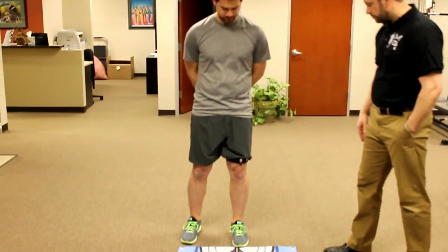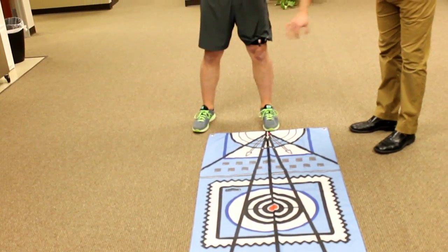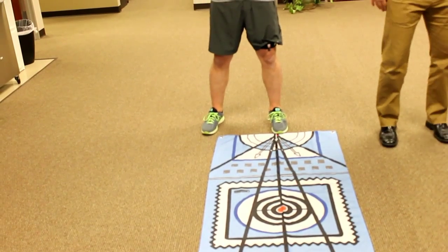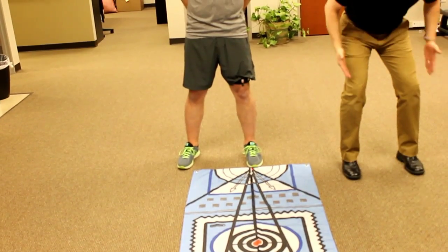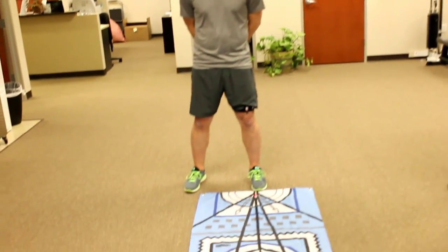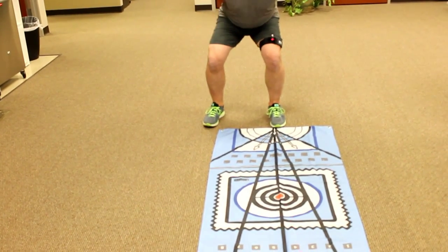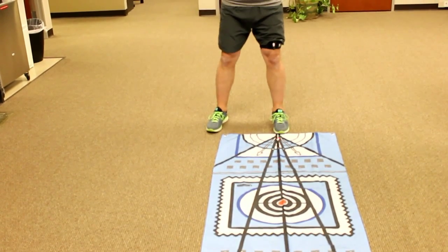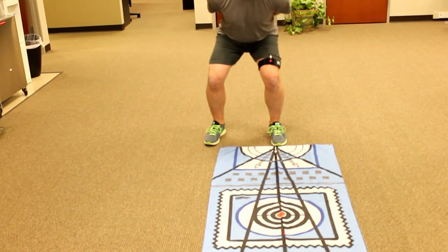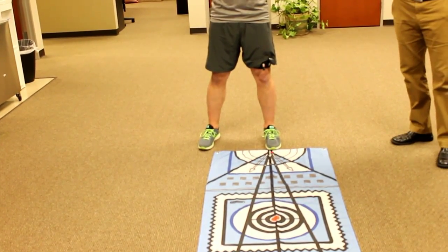Now I'll have you look at the laser and do a double leg squat. When we assessed you Chris early on, the laser wasn't going too far forward on the target and you had a lot of knee going forward with your trunk very vertical. I want you to be able to sit back — your shoulders need to come forward with that motion and your leg is going to work on getting parallel with the ground, which means that laser is going to go out beyond the end of the flag. So see if your shoulders can come forward. Try to get that laser all the way out past the flag. No excessive valgus motion there. Hips are coming back at the bottom and he's in a nice what we call a ski jumper squat — really nice mechanics. He's already been able to change his early tibial anterior translation and his vertical chest by watching the laser.